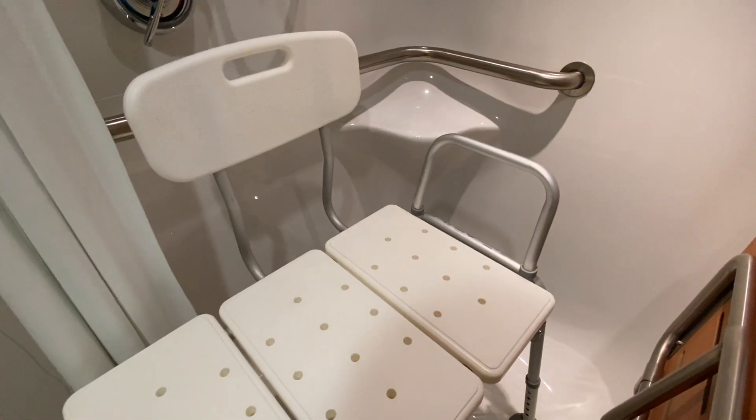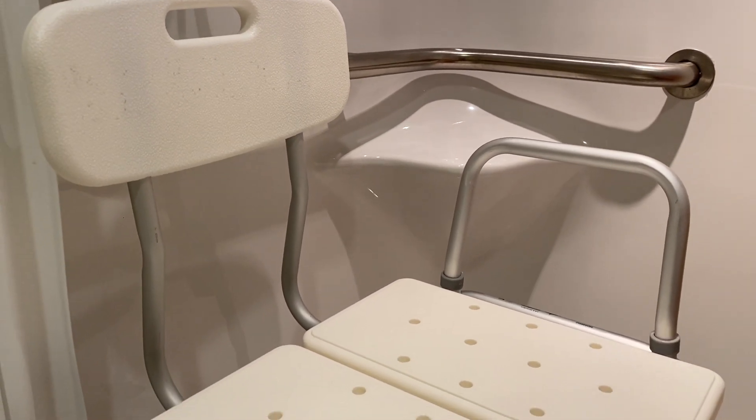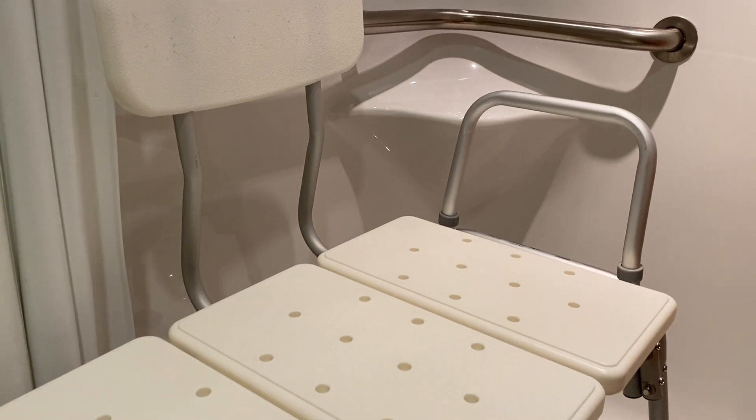If you have a shower inside of a tub, you may need a shower chair. A shower chair is a safe way to get in and out of your tub.